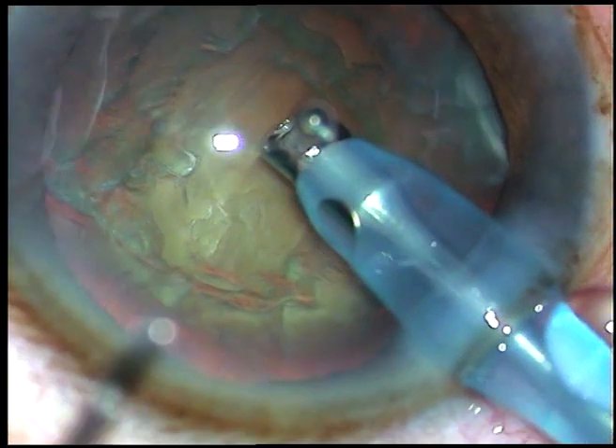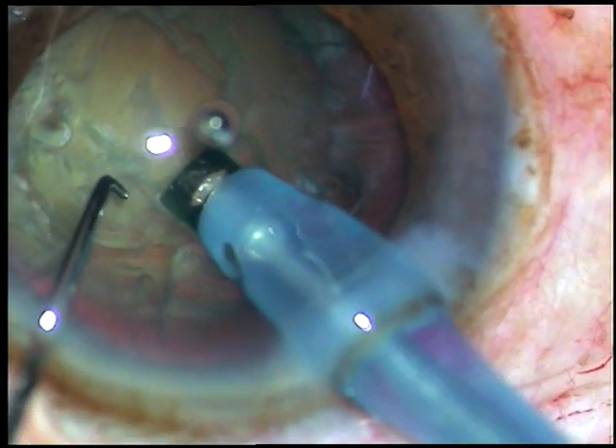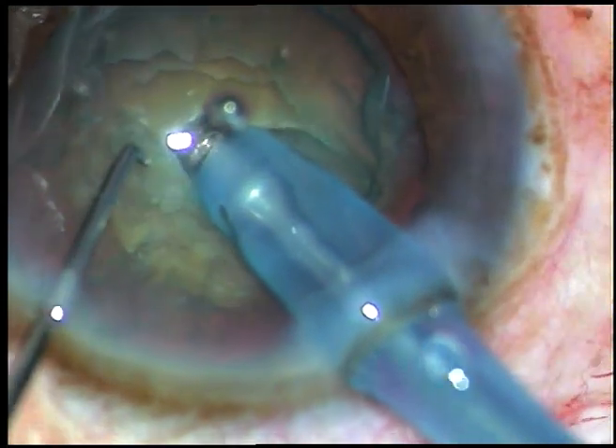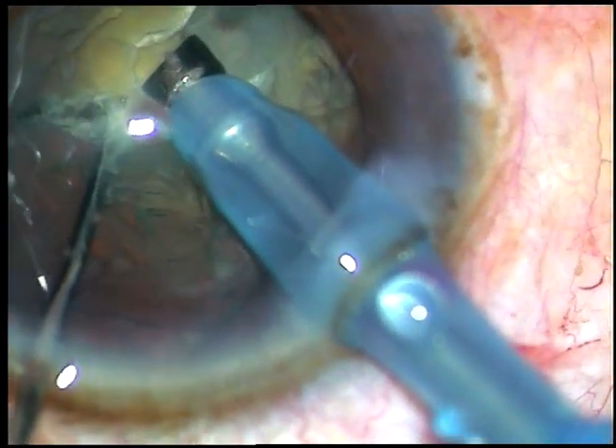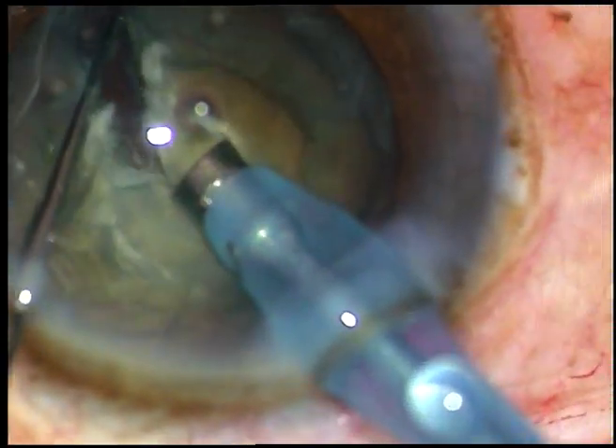I bury the tip into the substance of the nucleus, hold the nucleus very firmly — and this is the first chop. And it's a nice crack.